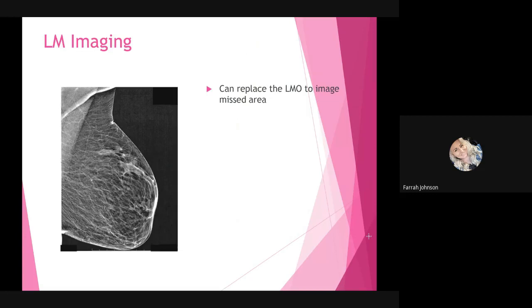So for LM imaging, this can replace the LMO to image a missed area. Typically the LM projections are not that commonly used unless you really have a patient who it's difficult to position for a different view. But these are not as common as the other ones we're going to discuss.